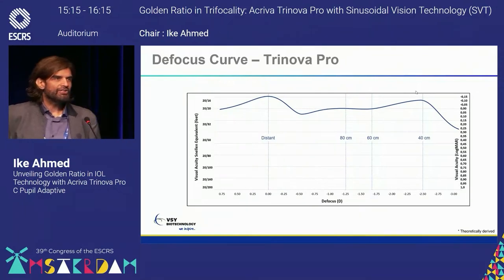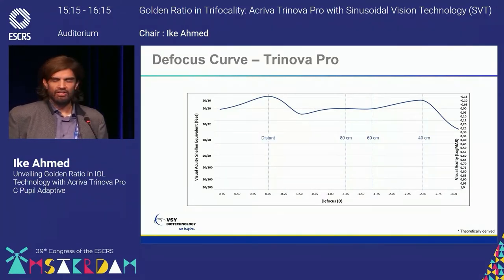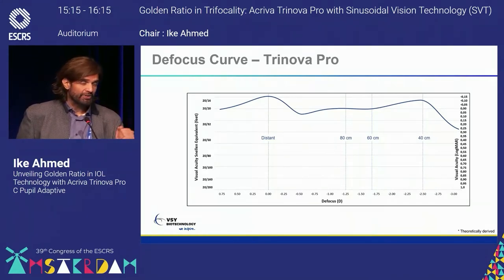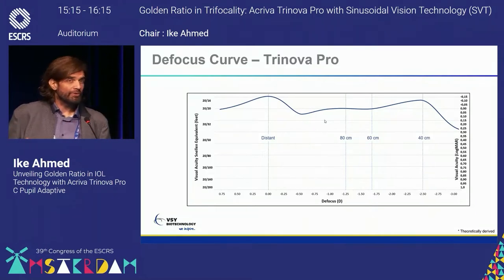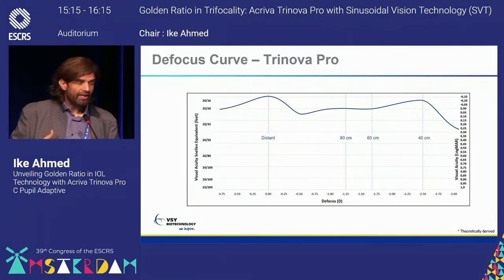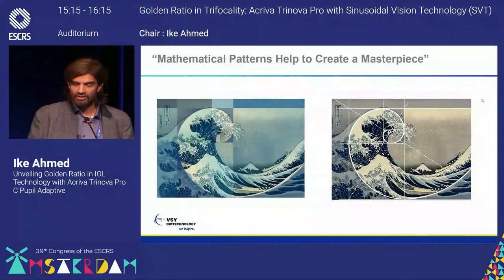Well, we all want to know how this lens performs clinically. This is a theoretical bench testing. This is a defocus curve. We always look at defocus curves when we think about the performance of a presbyopic lens. What we want to see is a flat top. We want to see basically a continuous range of vision, 20/25 or better, which is what we're seeing here at far, intermediate, and near. And you can see again that despite the fact that we are moving light around, we retain a high degree of focus, as seen in this example here.